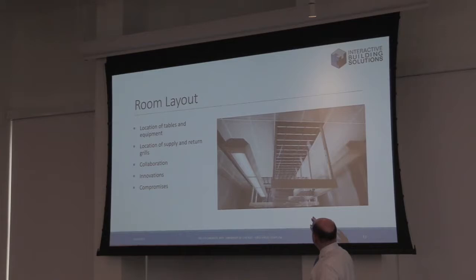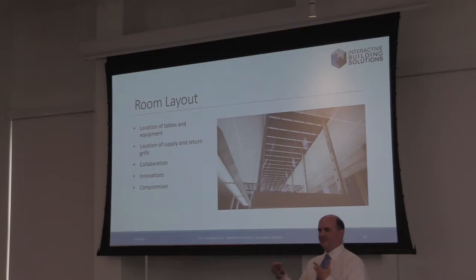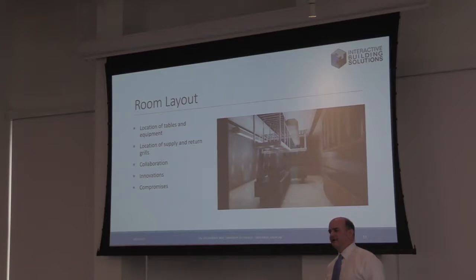When you're working, you're turning stuff on and off. There are changes that are happening above the table with monitoring equipment. You have people coming in and out. You really want to try and isolate your table from all of those different things. This airflow does that very, very well while maintaining a clean environment.